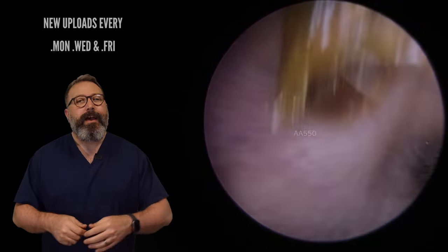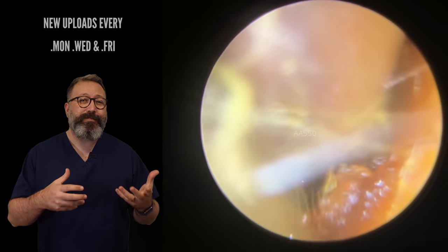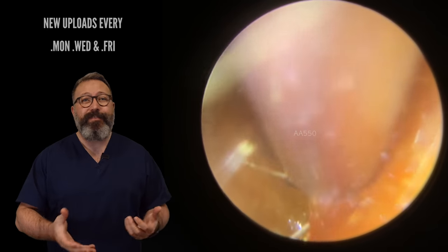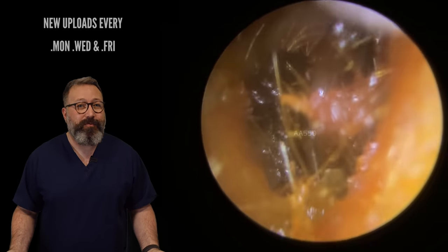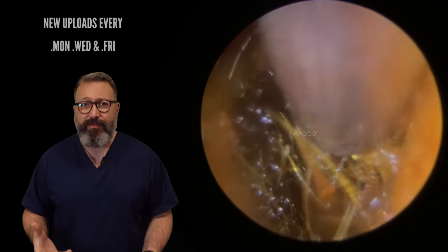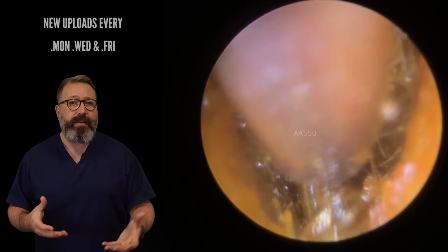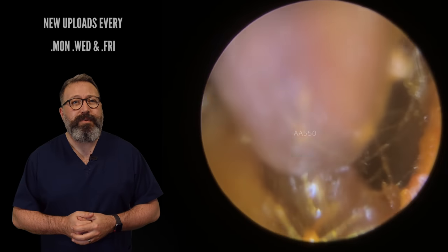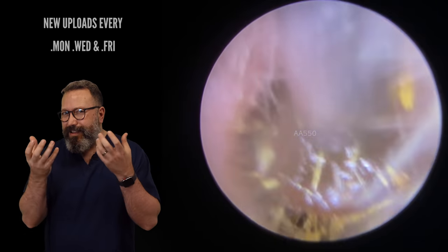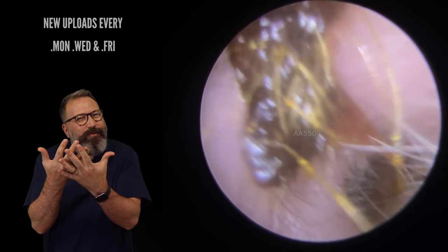They have a really important job — they're there to stop bigger bits of dirt and debris from getting inside the ear canal. My philosophy is if I can get it out safely without having to trim them, why bother trimming them? If a patient was really matted with hair in there and I really struggled with it, then we may consider asking the patient to go away, trim their hairs and come back. But you can see once you get past that outer section of cilia, you can get a really, really good view in there. That's the beauty of the endoscope — you can really get in behind the tools. Look at those hairs — they're all sticking out of that one.